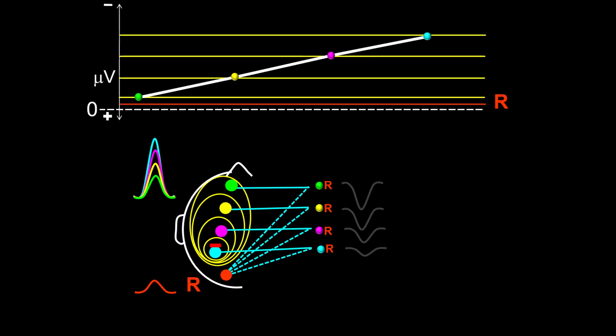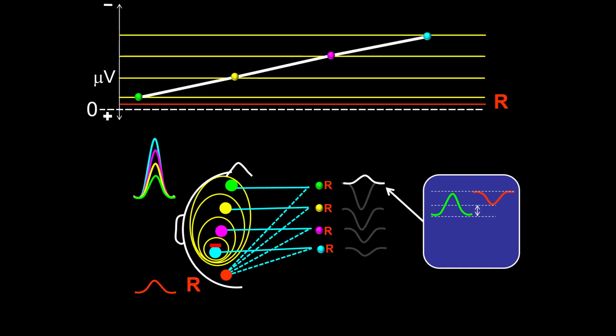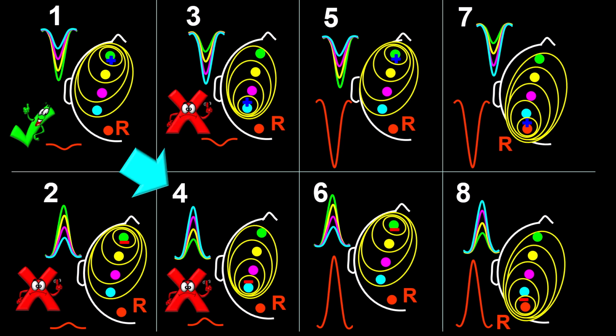Now I have added the corresponding voltage graph, and in this frame the waves are being placed in the blue box to represent what happens at the level of the differential amplifier. In addition, as you can see, the arrow points to the result of this arrangement, which does not correspond with the wave form from the first derivation of the waves in question. Hence, option 4 is not a sound option.